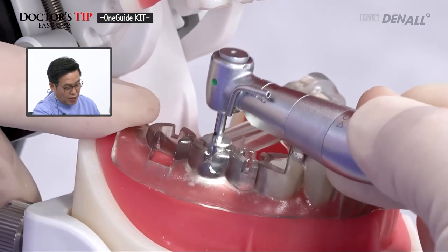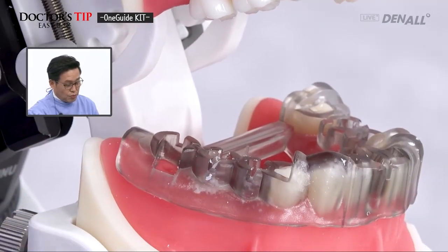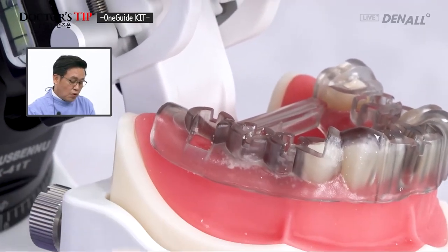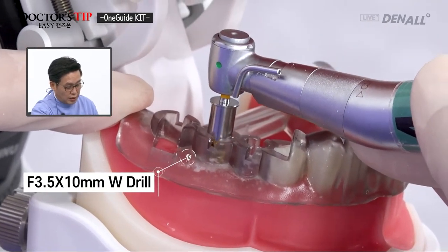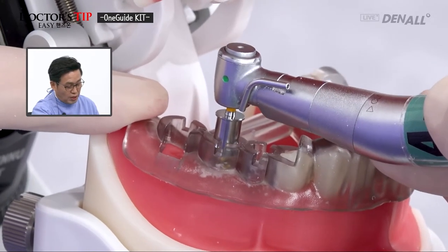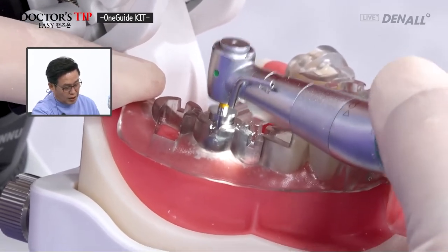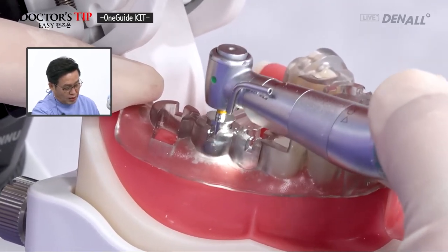If this is not full length, as I mentioned earlier, you use the flattening drill to flatten the surface. The 3.5 by 10 millimeter drill is chosen, and it's being connected. As I mentioned, the double contact concept is used. Now it is going to be in contact with the bone that has been through initial drilling, and the top part is going to be in contact with the template. The full length of drilling is going to be done, so full length up until the stop. We are going to do up and down to minimize heat generation.